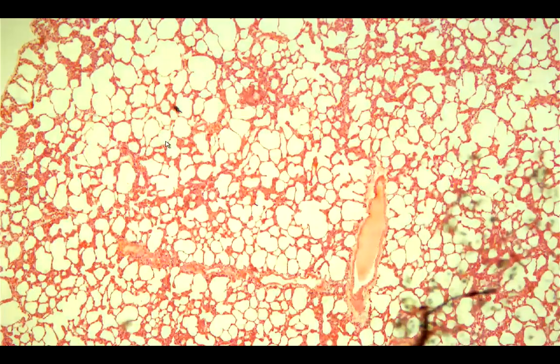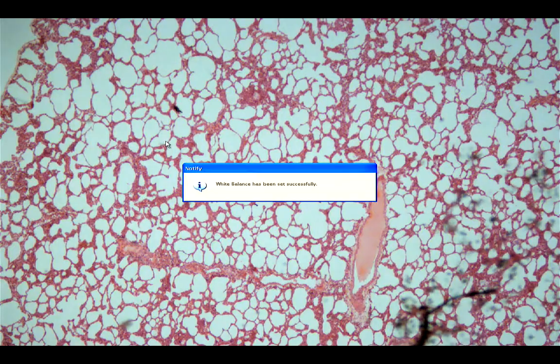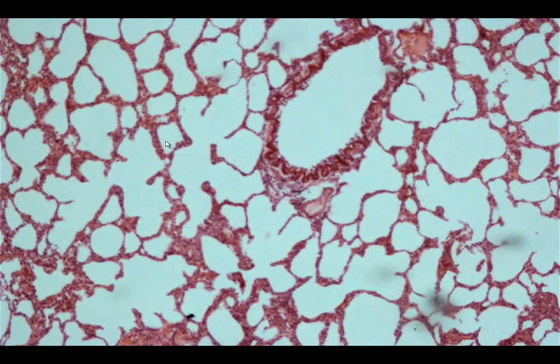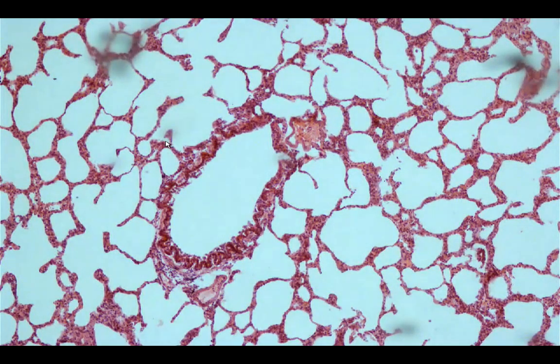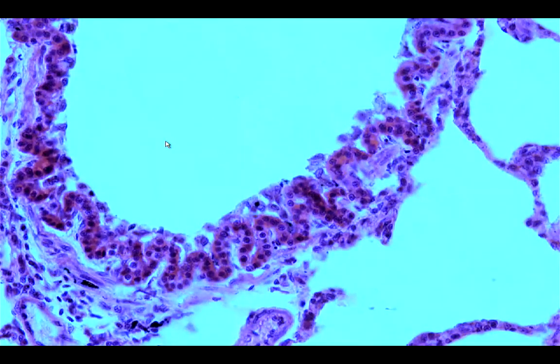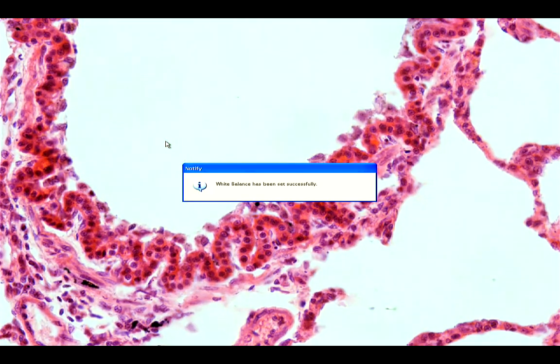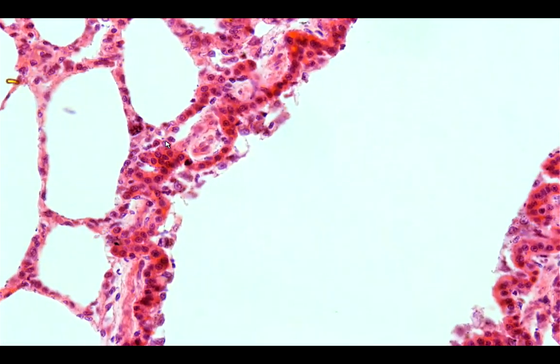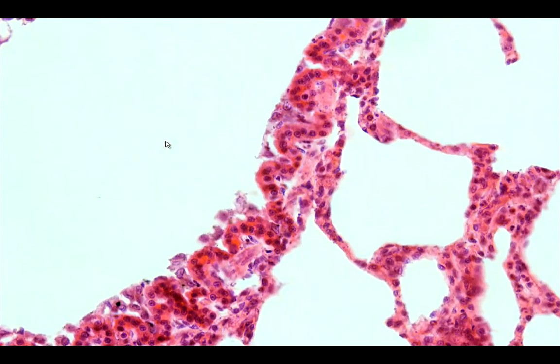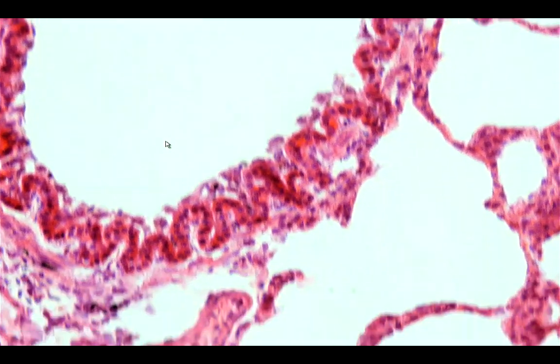There is another slide labeled lung. Similar to the bronchiole slide, we can see a bronchiole lined by simple columnar to simple cuboidal epithelium, with absence of glands and absence of cartilage.